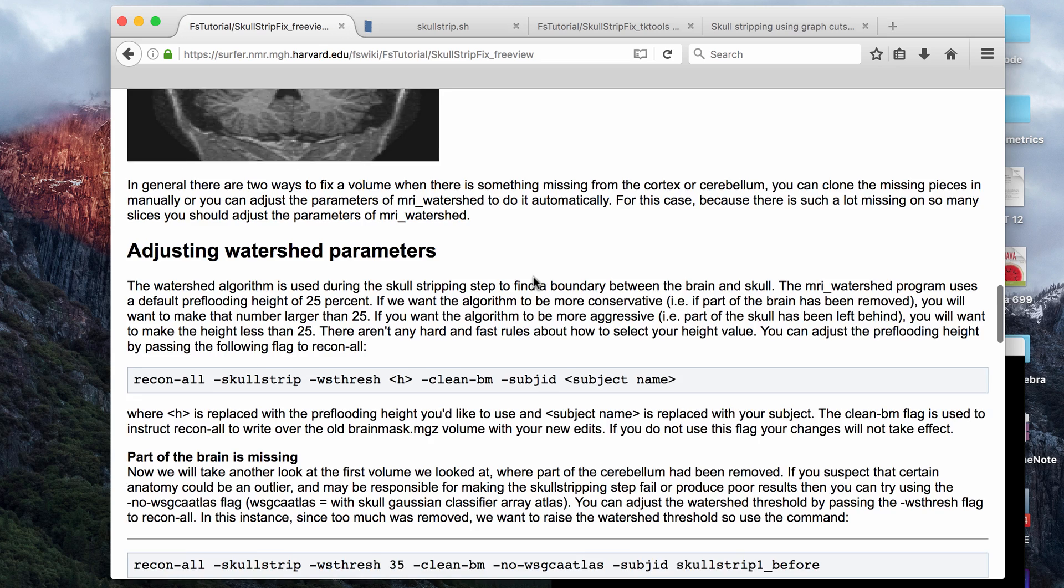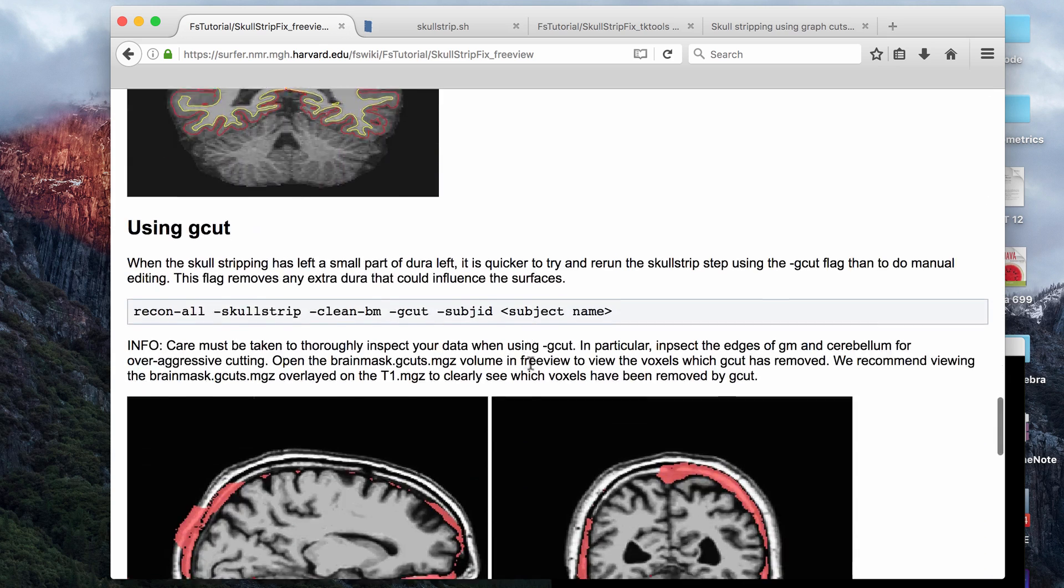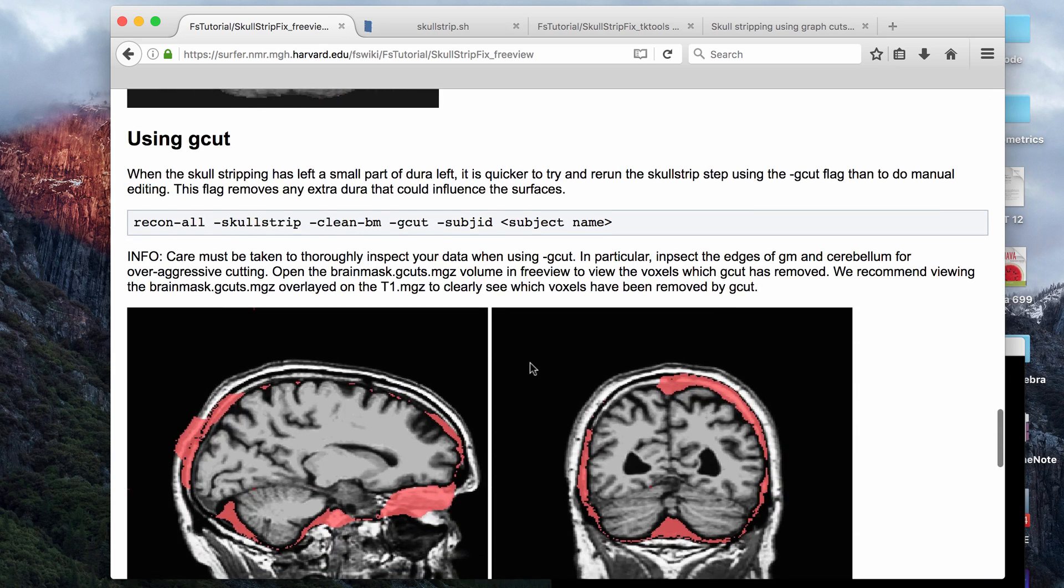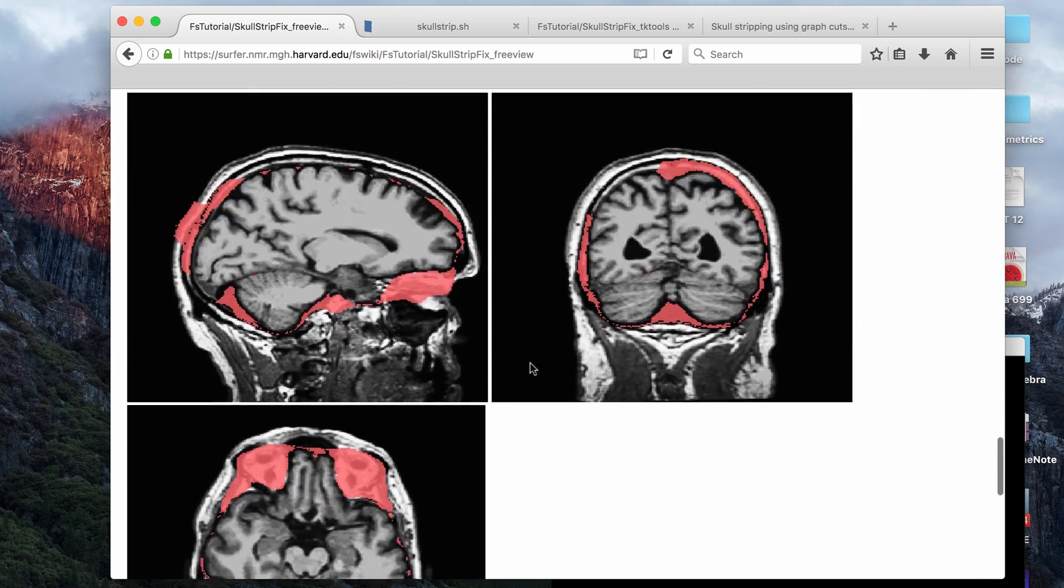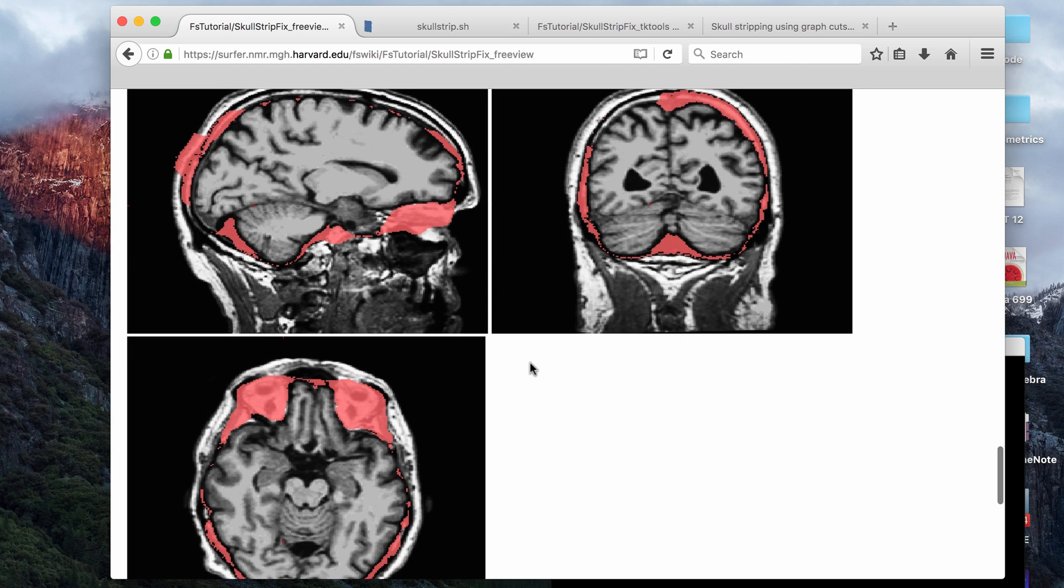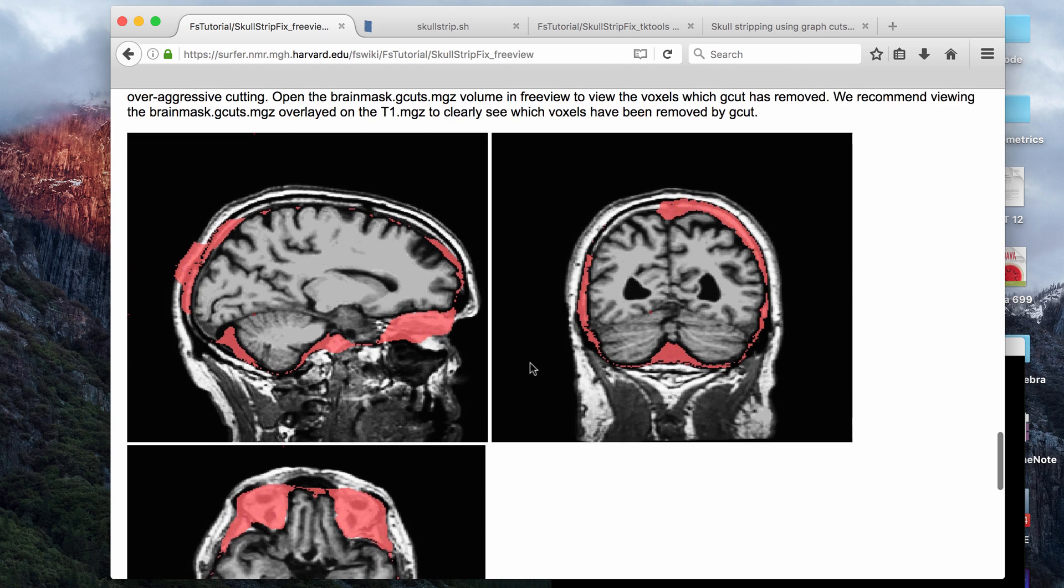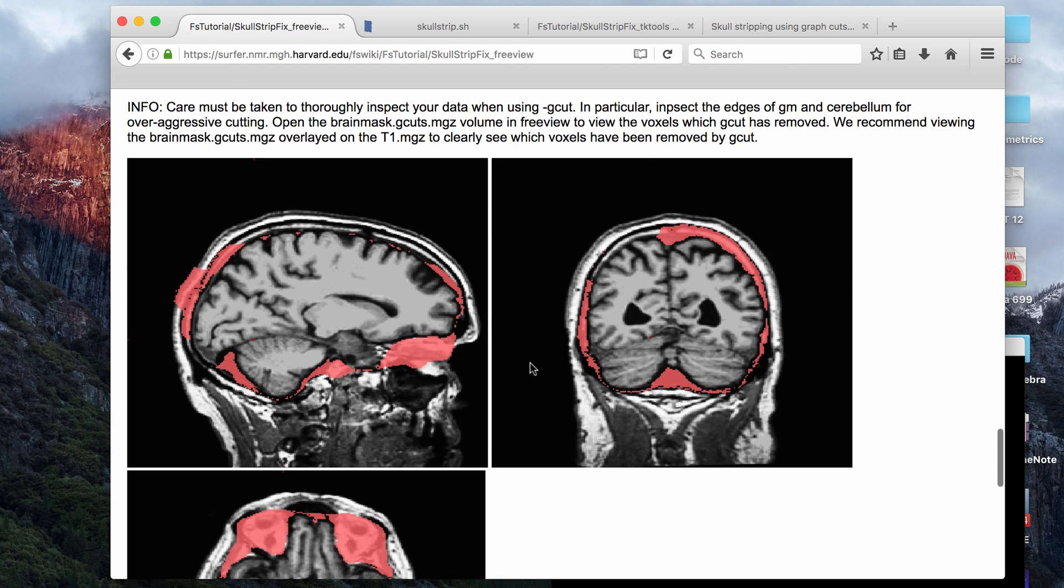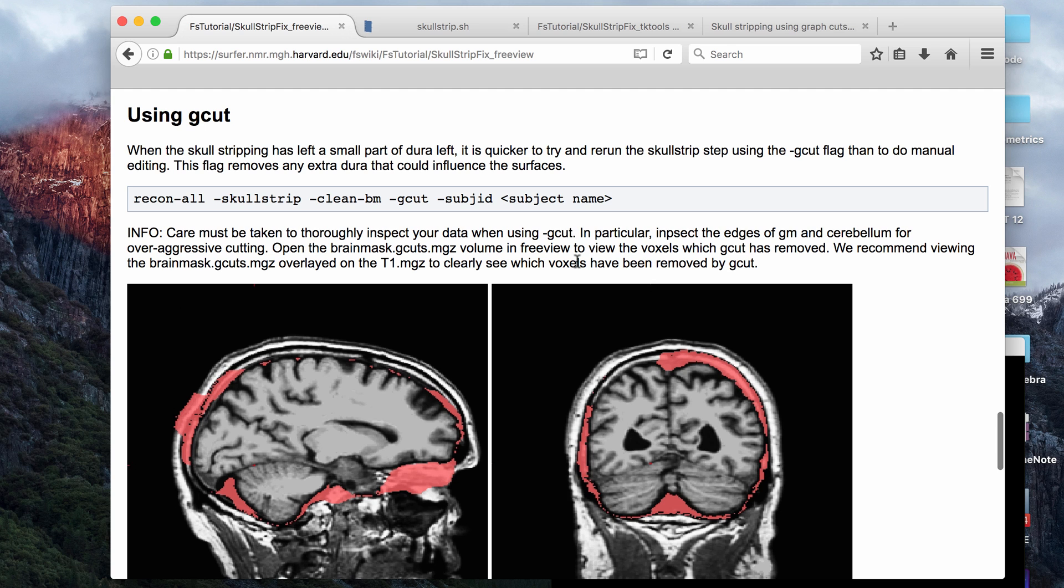The first command I'll go over in this video is the gcut command, and this is a command that you use if you have too much non-brain tissue left over in your brain mask. As you can see here, a lot of dura matter and a lot of non-brain tissue can be left behind, and gcut basically removes this by doing a more aggressive skull strip.